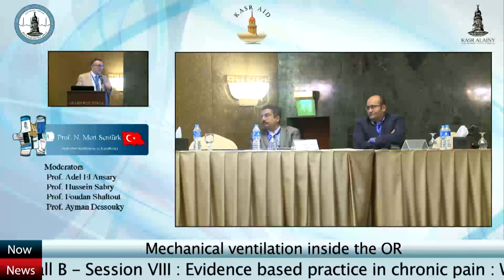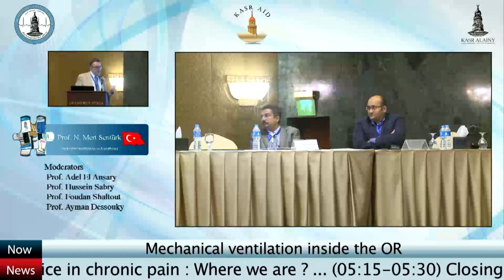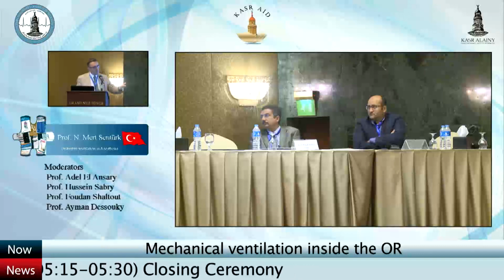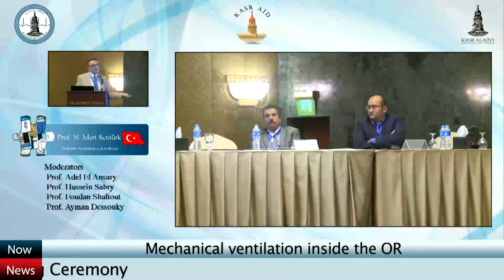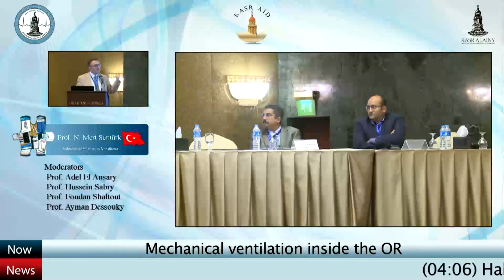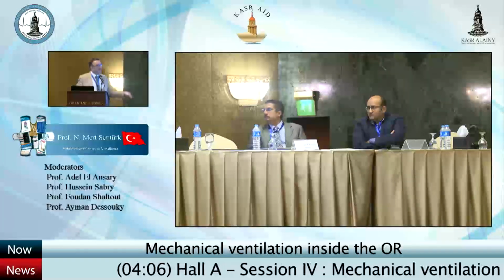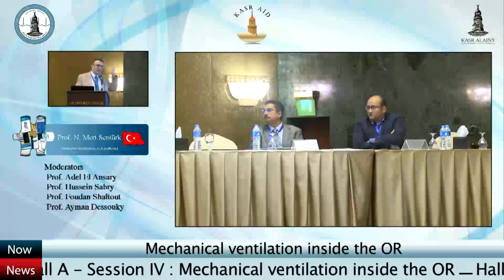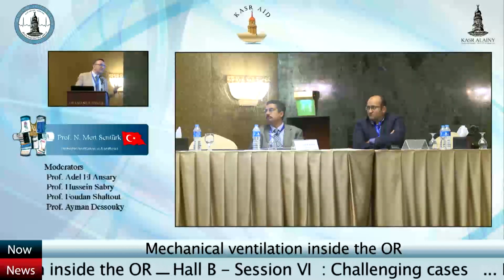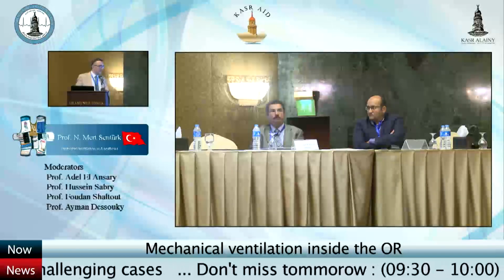We always give some PEEP. Actually, it would be a good idea to make a PEEP titration in every patient, and then apply this PEEP to the patient. This has been shown in a study from Spain, and there was a very significant difference between the constant PEEP and the tailored PEEP. Therefore, tailoring the PEEP, personalizing the PEEP, is a good idea, but it's not very easy, and we don't have the ventilators for this at the moment.